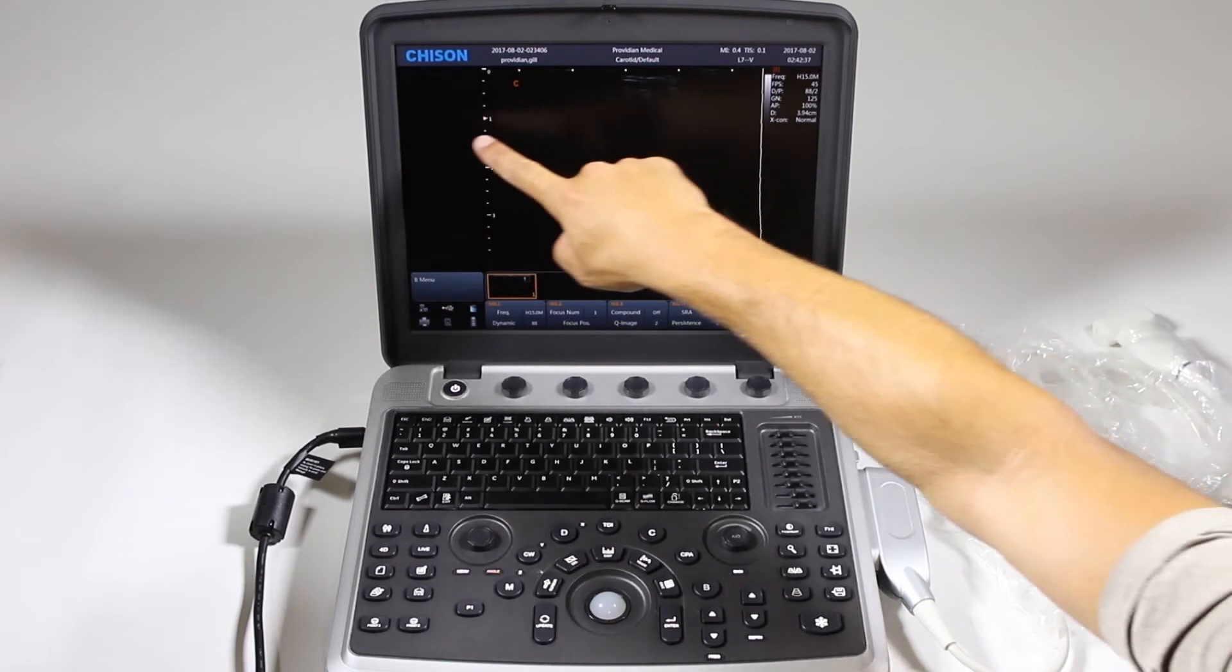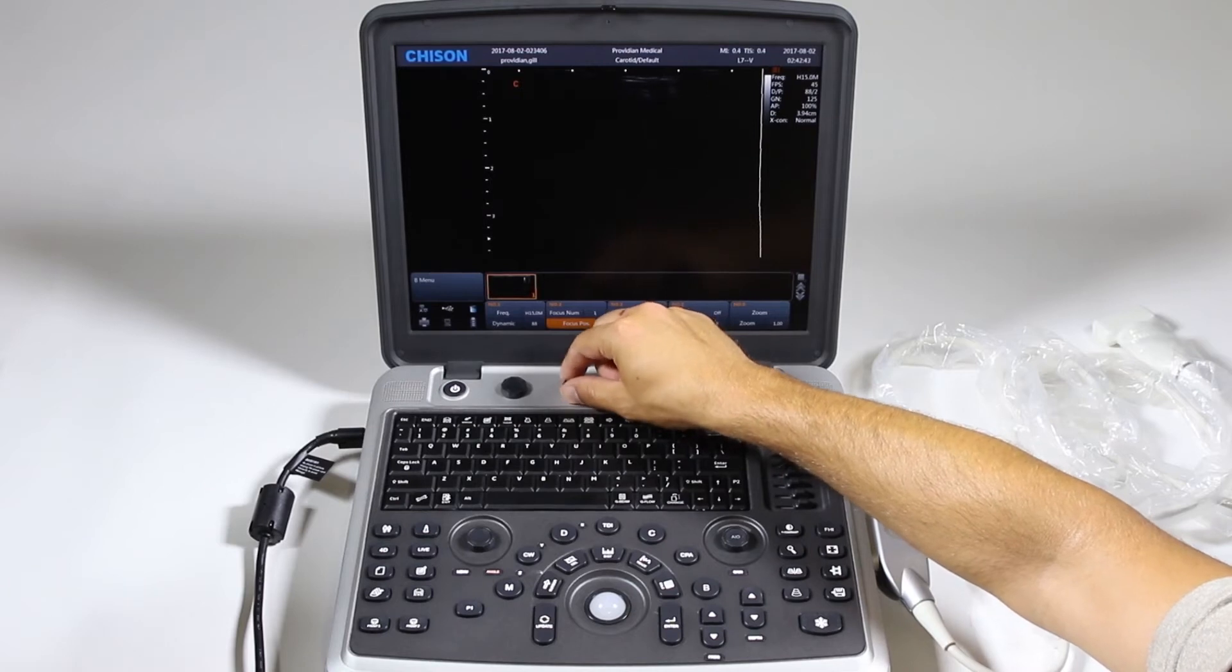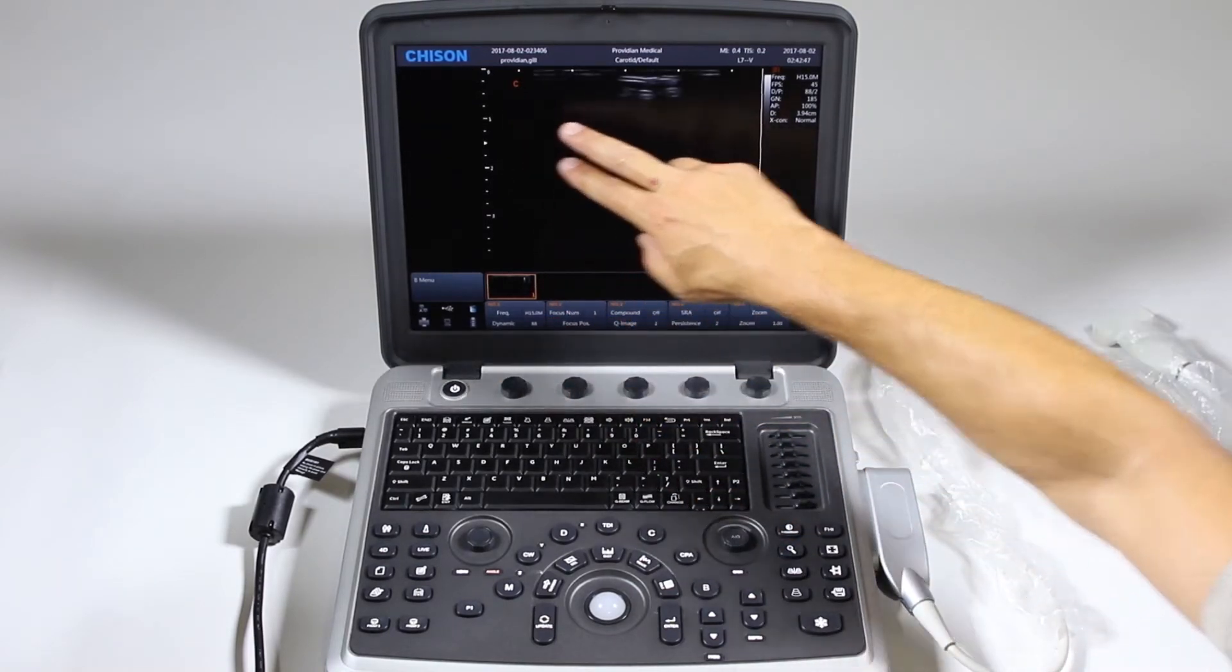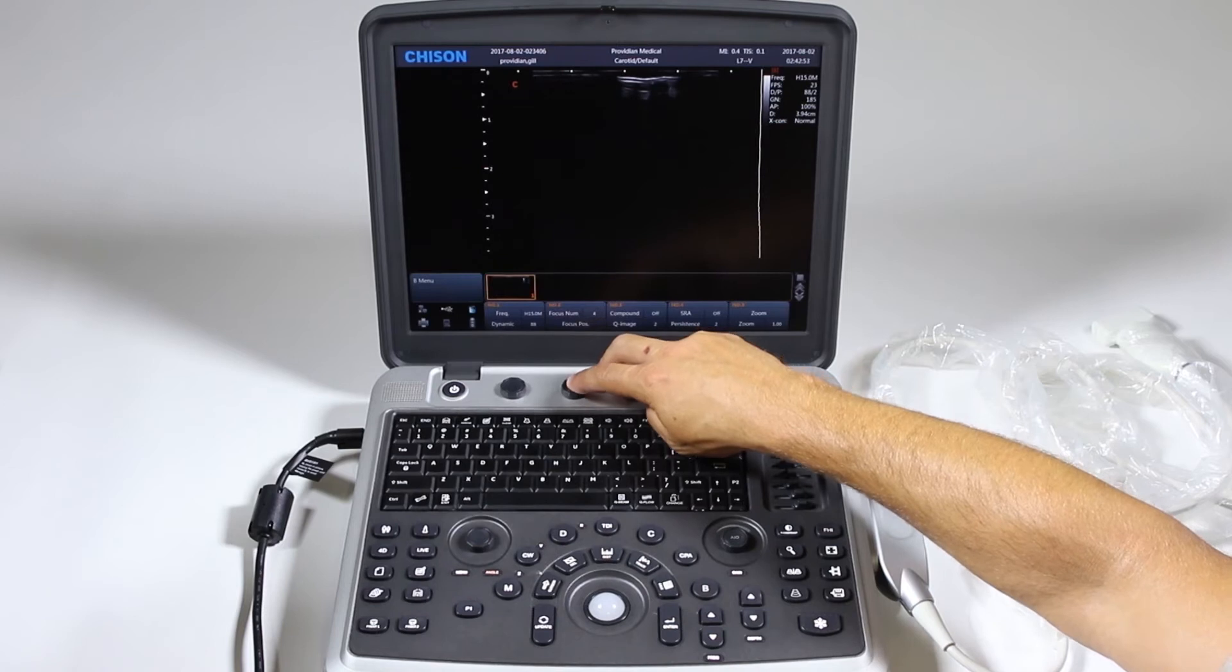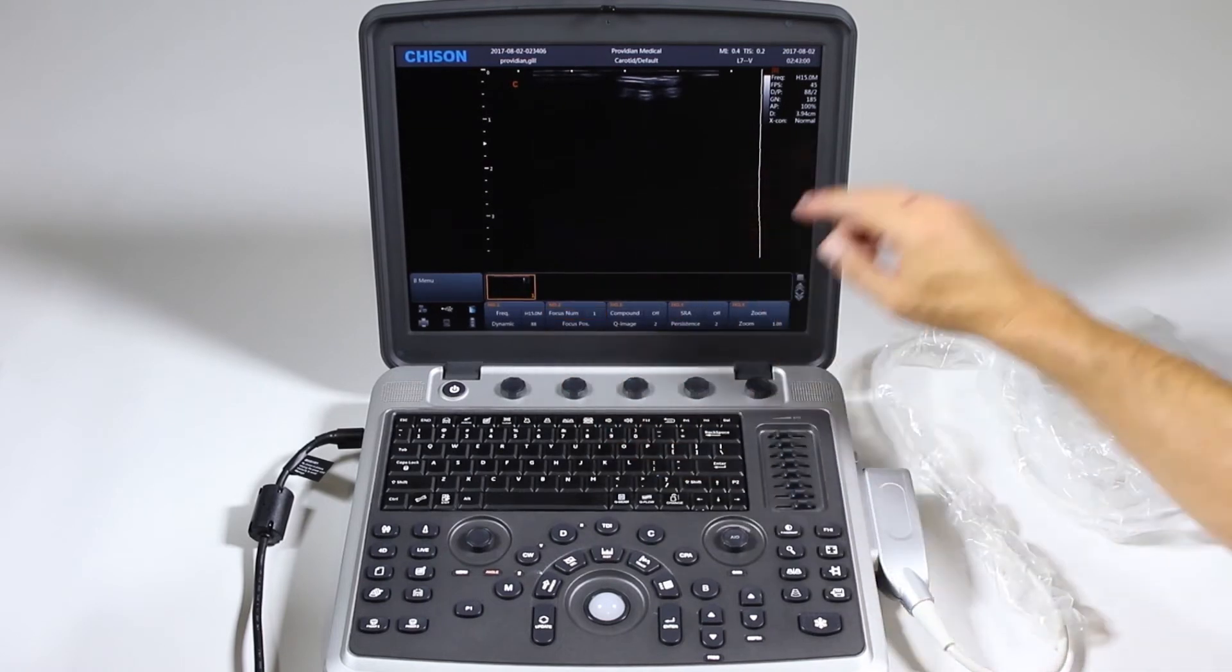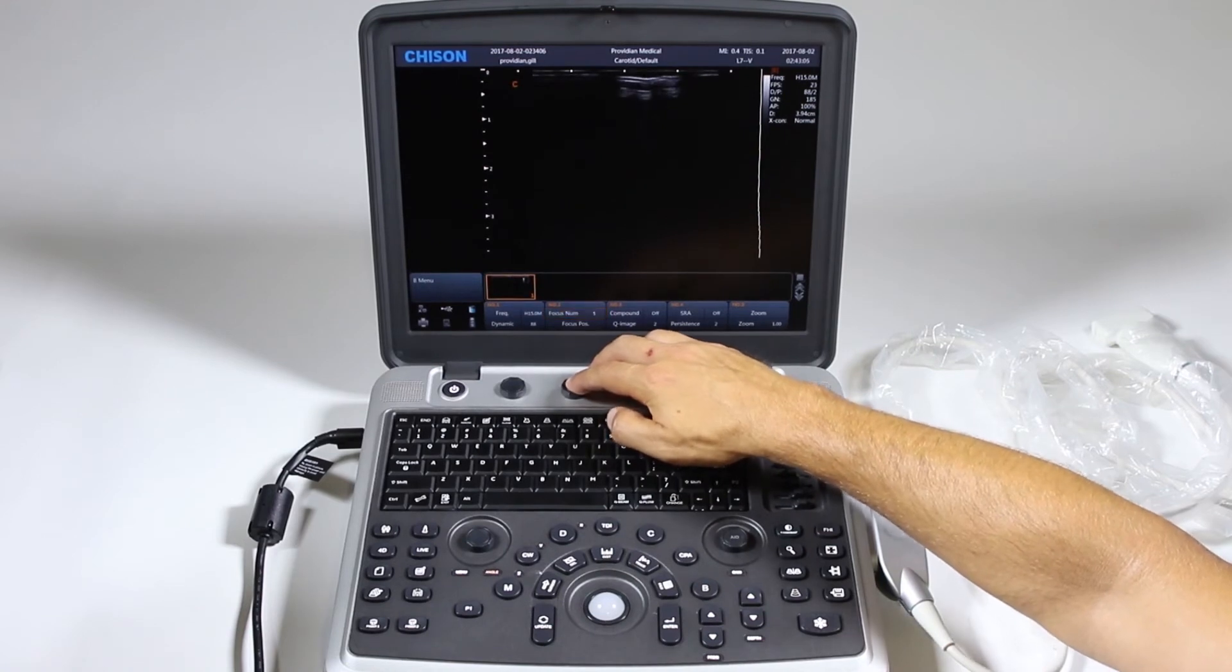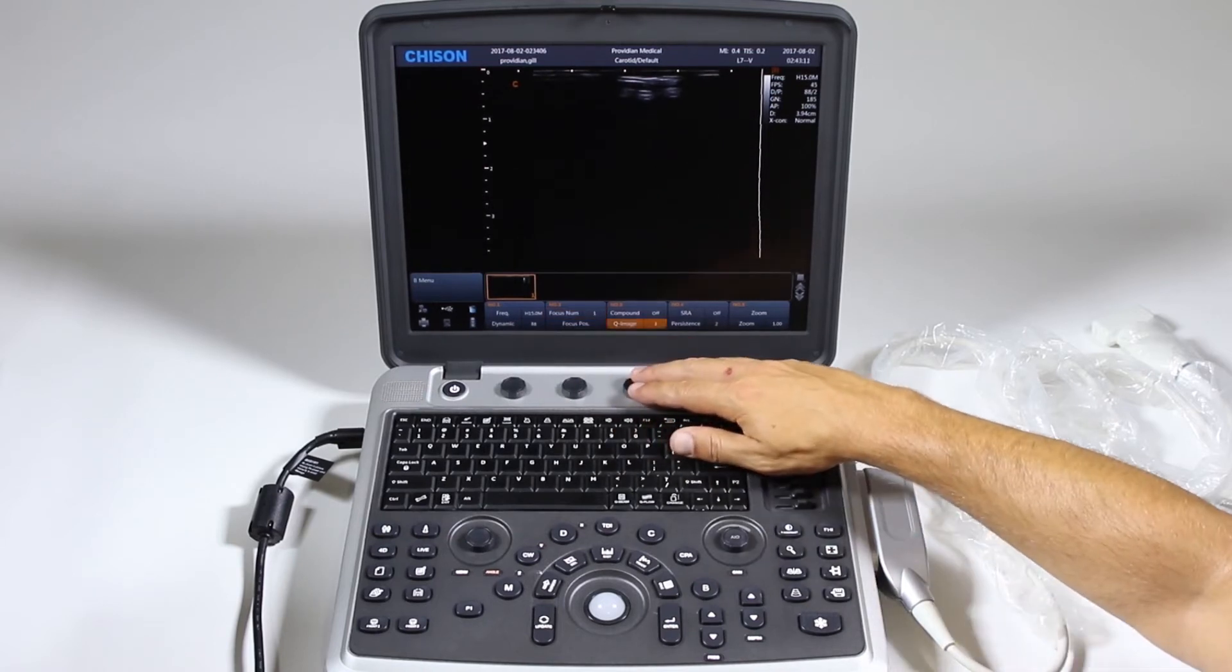These focal zones will improve the image where this arrow is, moving the position. It will change the image throughout as to what you're scanning, and it'll focus on where you want the best resolution. And you can add focal zones. Remember, each focal zone that you add will reduce your frame rate. So I'm down to 23 frames per second with five focal zones. So I go back to one, and I'm up to 45. And each time I go, 23, all the way down to 23. And then when I get back up, I'm back to 45.